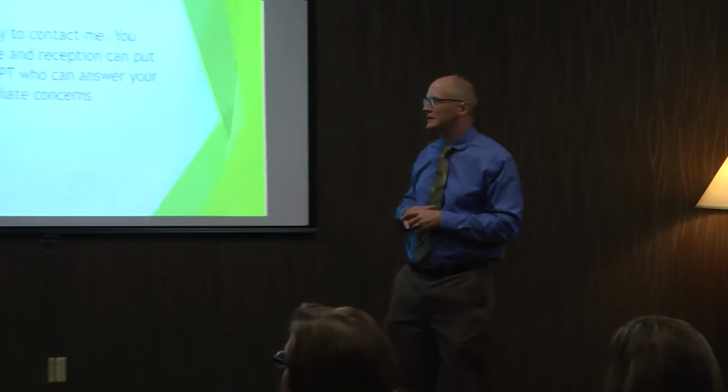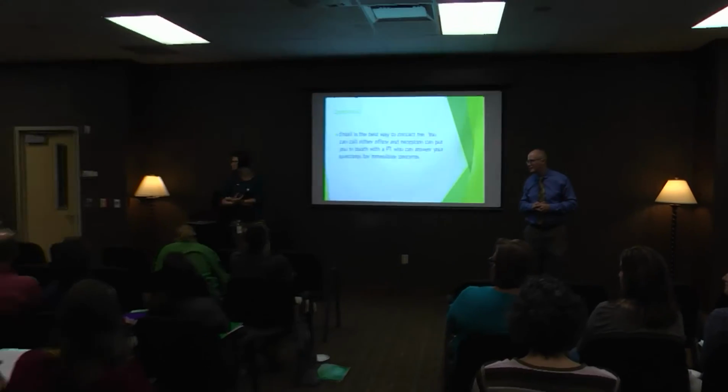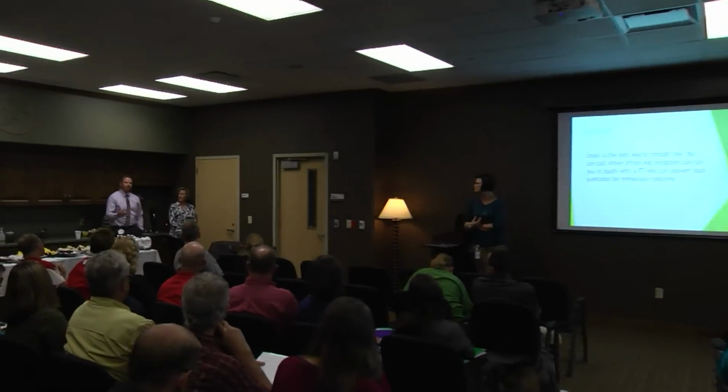What about stress fracture after partial knee? It is something you can see. All the advantages we talked about with partials, the one theoretical drawback is that because you're only resurfacing a portion of the tibia, you're placing a metal component and cementing it in, and it has less bone support. There are certain things we can do technically that decrease the risk. An appropriate fit of your tibial component greatly decreases your risk of a stress fracture. So, just like you mentioned, the sizing is very important.